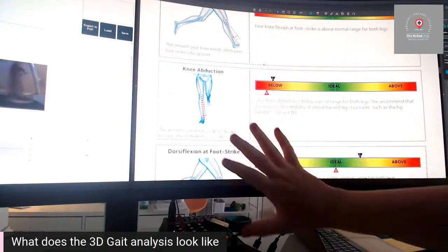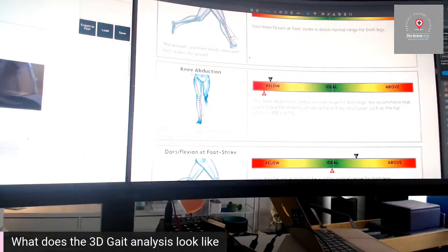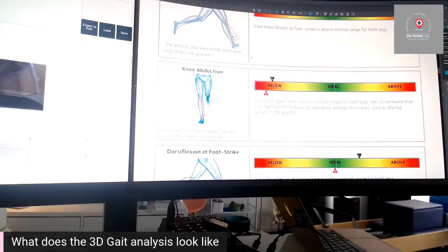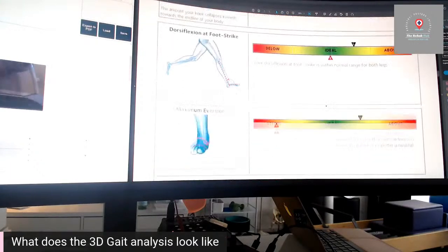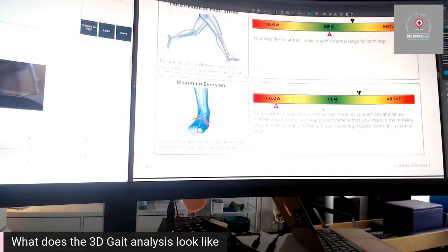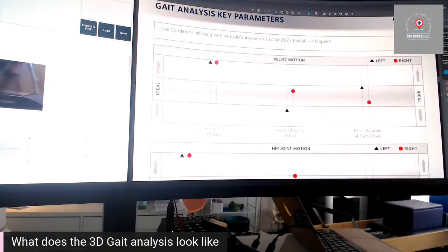Some people love this, it gives them loads of information. Other patients have maybe been referred over from their physio or other healthcare provider, and we essentially just do the movement analysis and then hand them back with this report to their healthcare professionals. We do a lot of that, or they get the rehab with us. So there's a good mix there. It gives them this traffic light system of where they sit within the mean, and it starts to build up a picture of why they're getting maybe an overuse injury or a particular pain output.